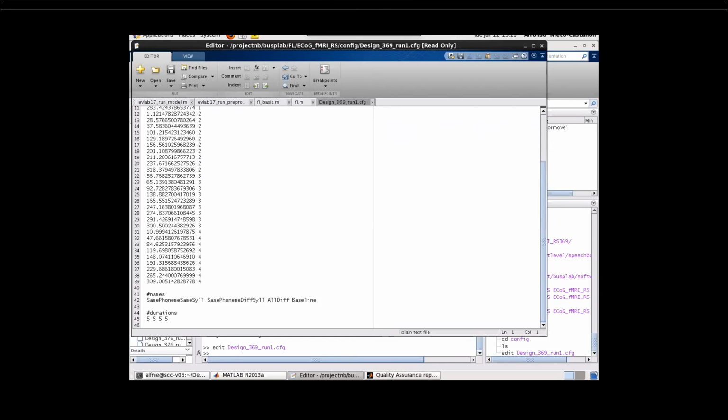So whatever happened at the middle of the TR, wherever a slice was acquired at that time point, is the reference slice used by slice timing correction to correct everything else. That means you are getting a scan for a time point that corresponds to the middle of your acquisition.